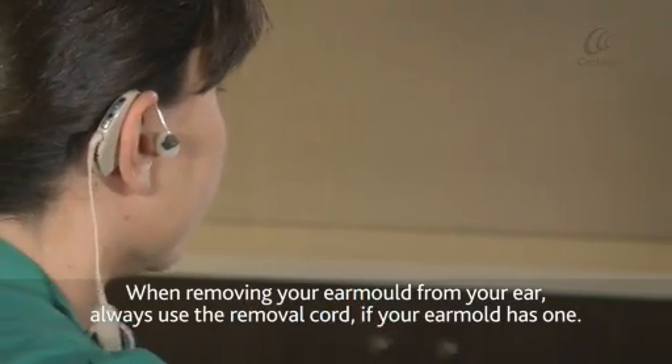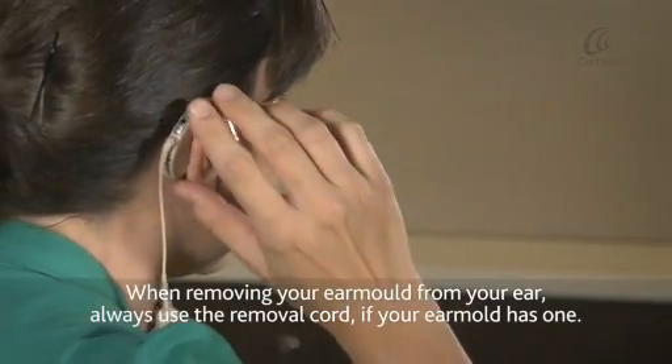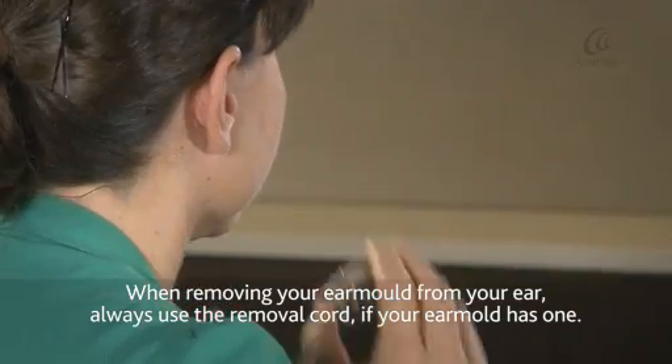When removing your ear mould from your ear, always use the removal cord if your ear mould has one.